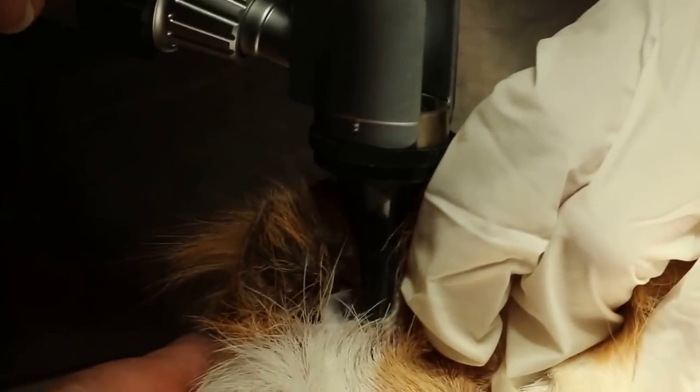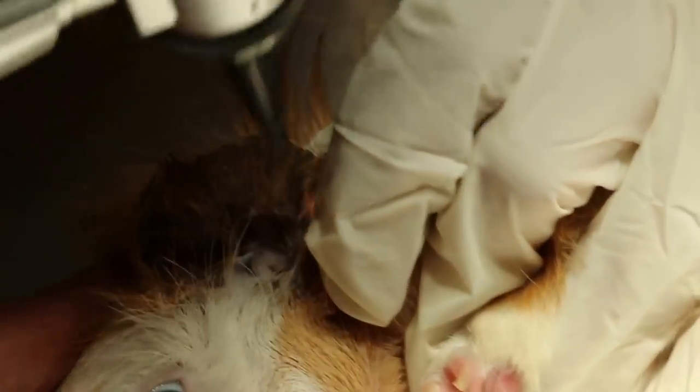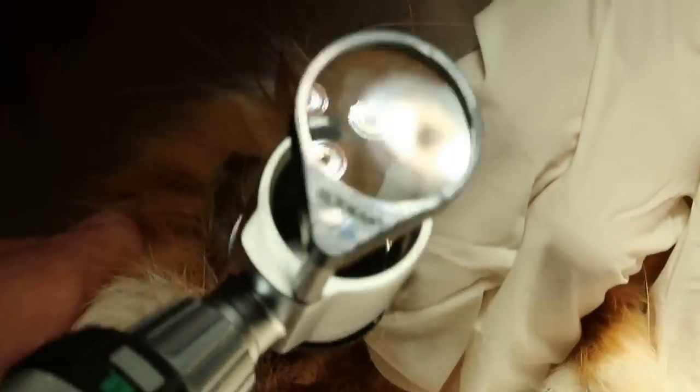The other thing is ear cleaning. We take the otoscope first and check for any dirt or mites. We'll take a look now — checking with the otoscope. Okay, we can see already. So then we'll do the ear cleaning. This is just a demonstration.